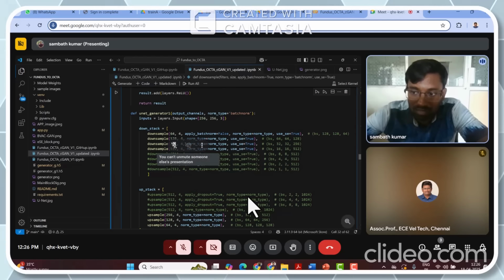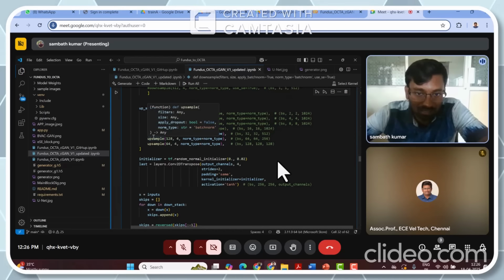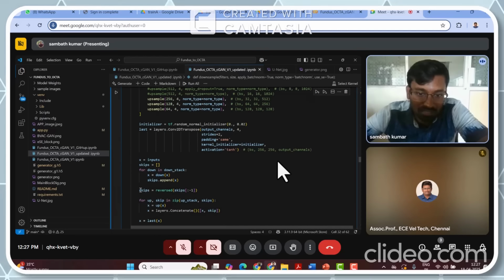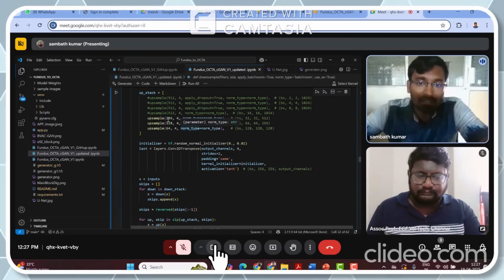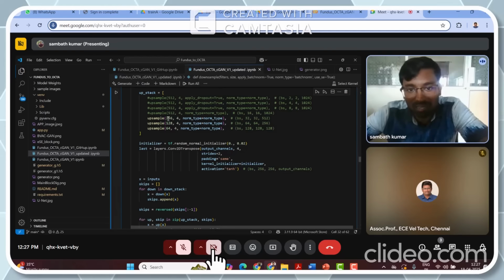Then from the bottleneck layer, it will be passed into the decoder stage. In the decoder stage, we are having 3 stages. The fourth stage has the first stage of the bottleneck, which will be available here. So this is the fourth stage of the decoder part. Then in the remaining 3 stages, we are going to bring back our original spatial resolution, as well as reduce our depth features. So this is exactly the reverse of the encoder stage.